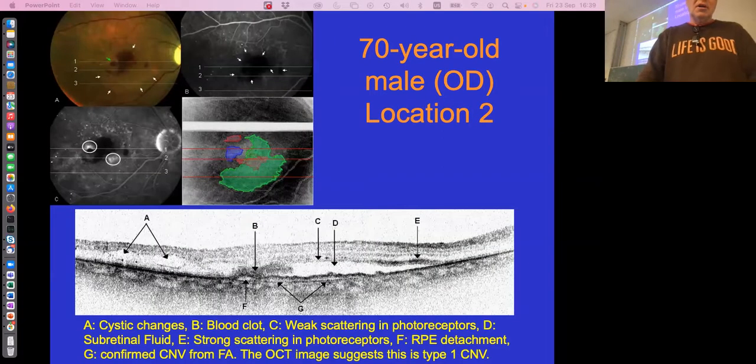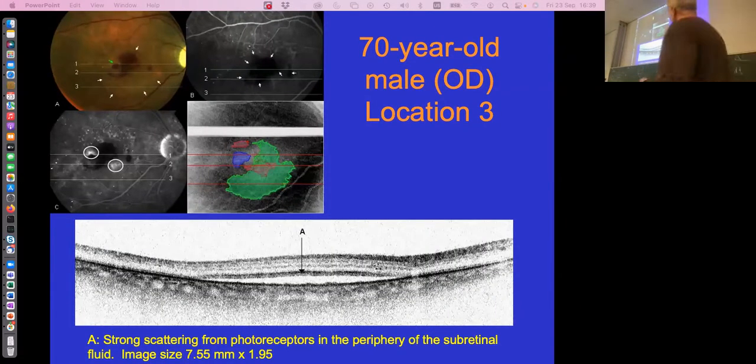And then slightly away from it. And then when you go to the periphery, you can see again the fluid membrane, but over this fluid membrane, you can nicely see that the photoreceptor layer is still intact. Over the full length, you can see that they're still there. And okay.